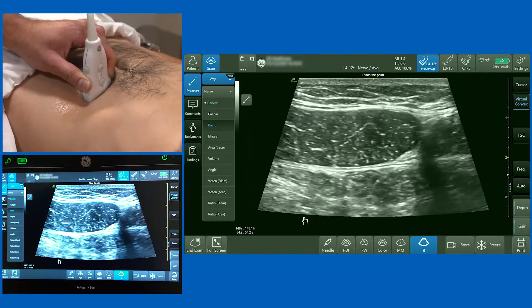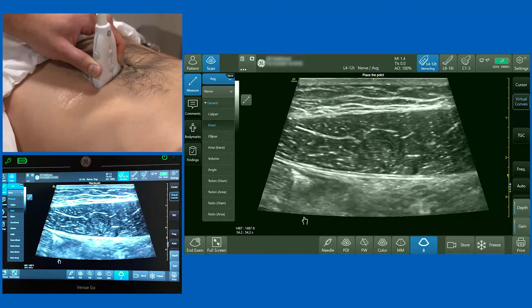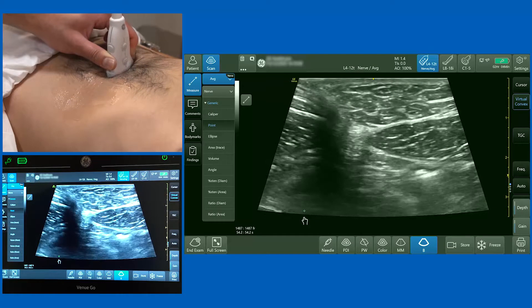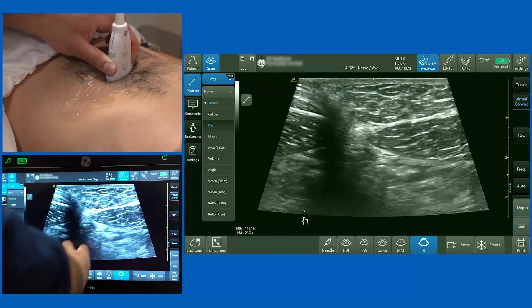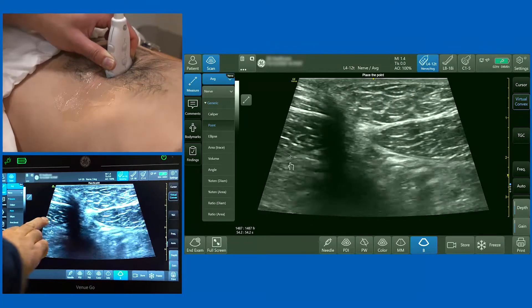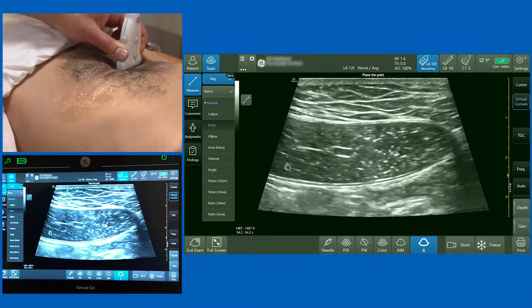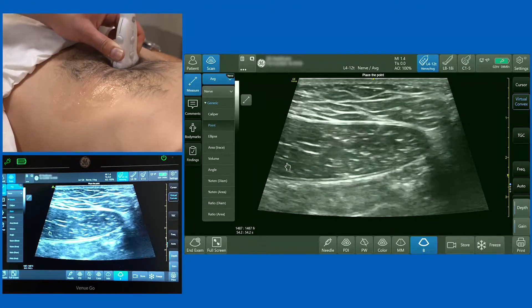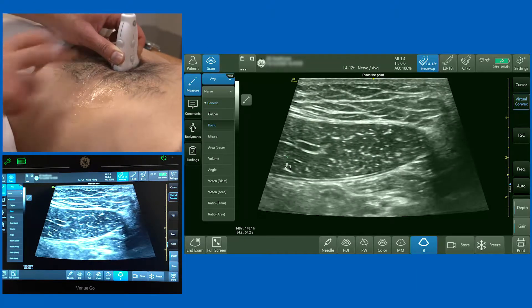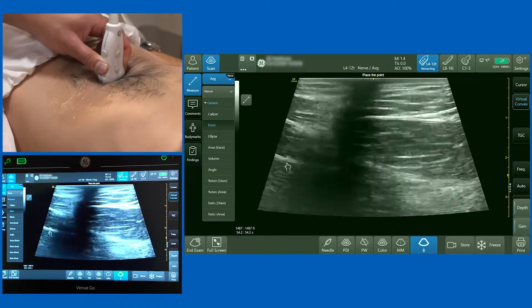To orientate ourselves further, I'm going to slide the probe towards the midline. Scanning the rectus abdominis in cross-section, we reach a point where it's deficient — that's the linea alba, the midline. As we scan to the lateral side we're now on the rectus abdominis on the contralateral side. When performing a rectus sheath block you need to inject local anaesthetic on both sides, because there is bilateral innervation of the midline.